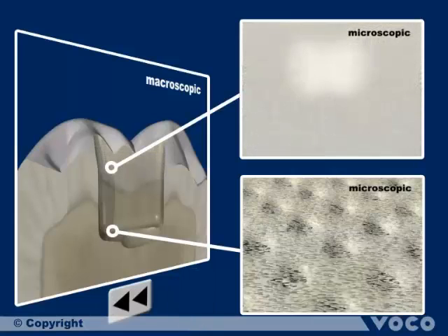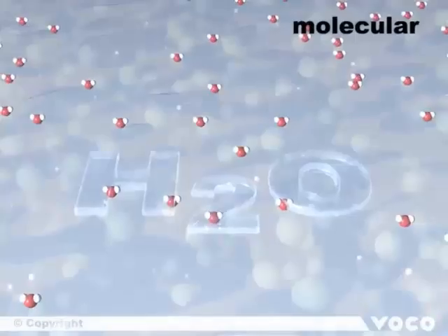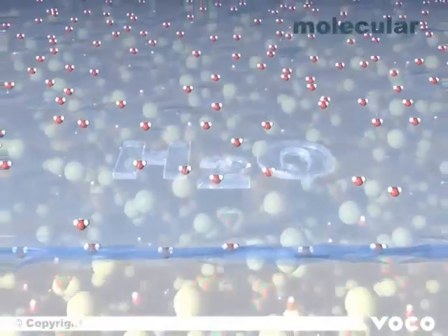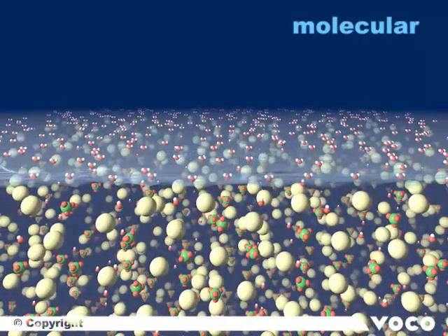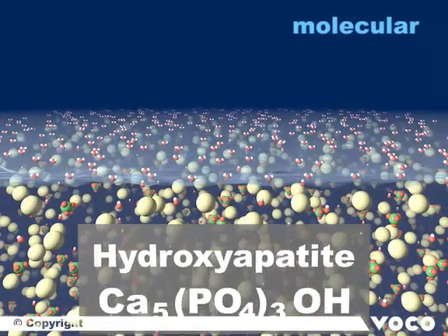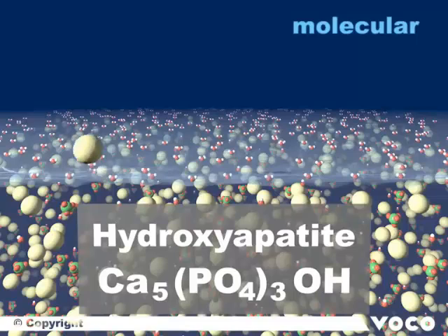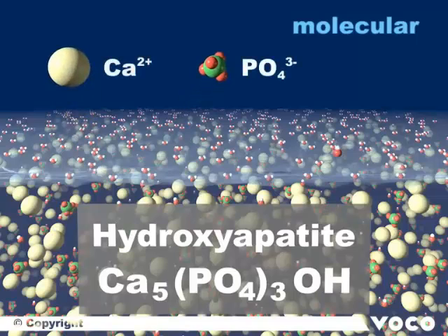By looking again at the process on molecular level, we will understand how the chemical mechanism of the connection between tooth substance and composite material works. Due to the preparation, there is a thin water layer on the tooth. Hydroxyapatite, the main component of the tooth, consists of calcium, phosphate and hydroxy ions.